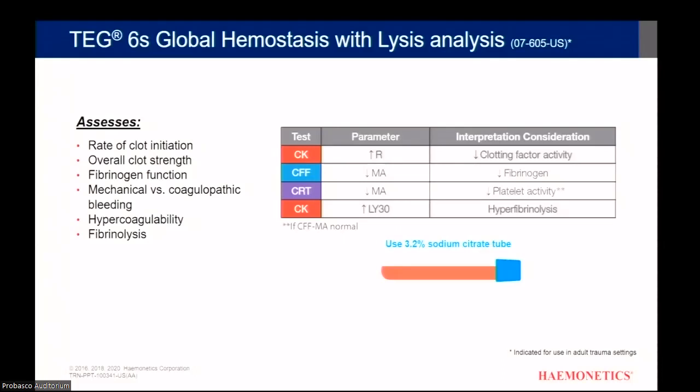Typically, I think limitations that come with citrated tubes are to do with the manufacturing of the tube. The reagent that lives in the citrated tube needs a certain amount of blood in there so that when it mixes, it anticoagulates appropriately. Best practice is still to fill to the line, but you can use pediatric tubes. You can use whatever size blue top tube. It takes less than an ml of blood to run the cartridge, so there is flexibility as far as how much blood you want to send. You can do it in a smaller blue top if you want.